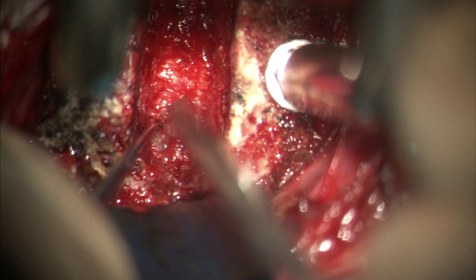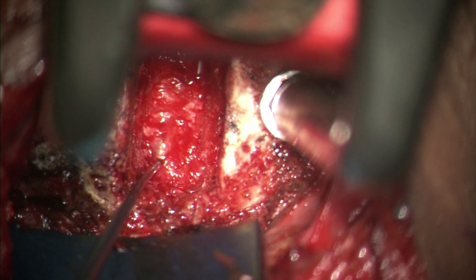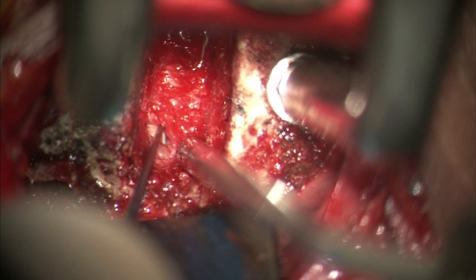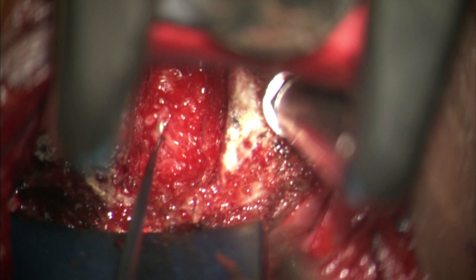The posterior longitudinal ligament (PLL) takedown can be done in the midline, or sometimes a plane can be found on the lateral edge of the PLL, as seen here. To perform it, a nerve hook is used to elevate the PLL off the dura and the PLL is incised using a number 15 blade. Note that it is not mandatory to perform this in all cases; we prefer to do it when we suspect herniation of a disc fragment behind the PLL.